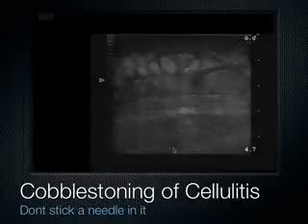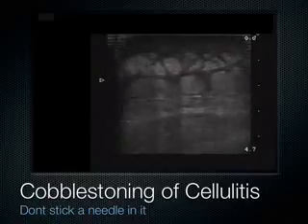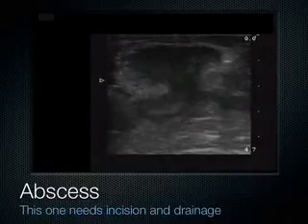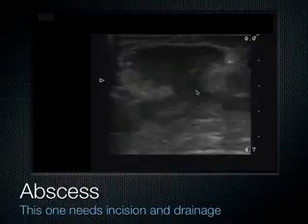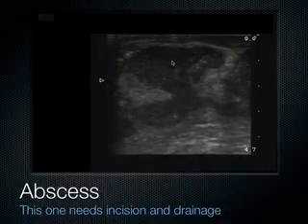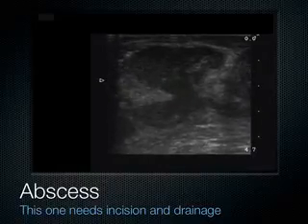Looks like cobblestoning. We can see these hyperechoic islands here of cobblestoning. Don't put a needle in that. That's cellulitis, as opposed to this, which is an abscess. And you can compress this swirling pus that swirls around like that. This is what an abscess looks like. This one truly does need surgical incision and drainage.